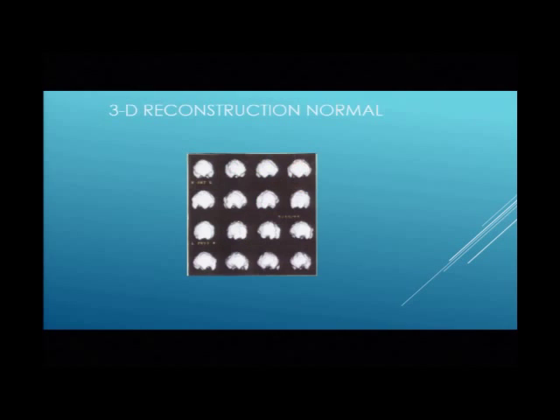And these are slices from left to right. So this is the front, this is the back, that's the top, and that's the bottom. Again, you see like a ribbon. They call it the cortical ribbon, and it goes all the way around, and it goes under. You can see it's nice and thick and regular, and it's solid red, and some places have a minimal interruption, which is not even significant. Then you see the white again, and you see the white also at the bottom of the brain. You can actually see that better in other slices, but that's not important.